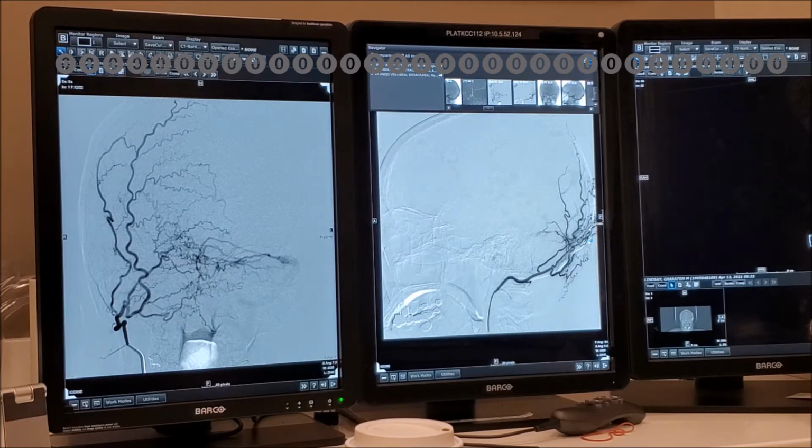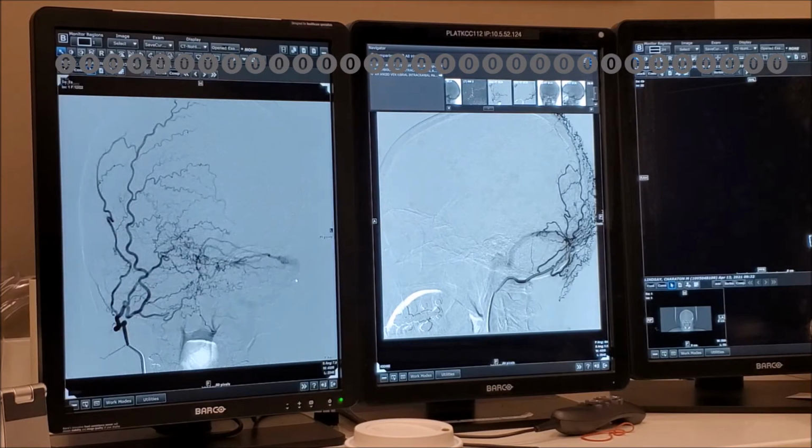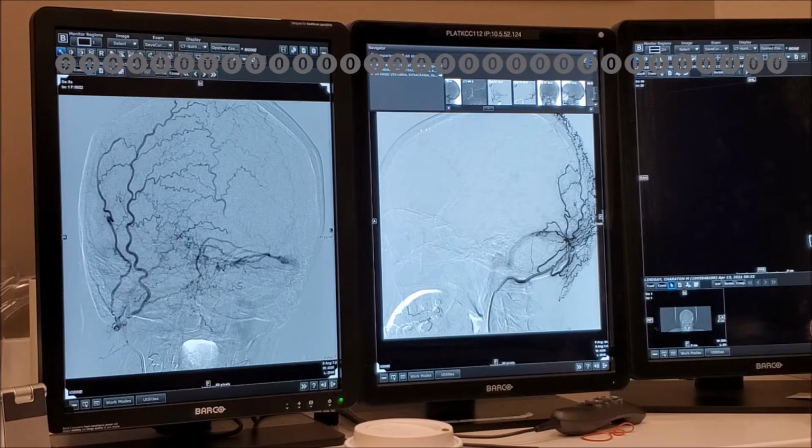I know one thing. It is transbony. It's not meningeal. But it reconstitutes, this is a meningeal artery. But it is through all this, you see all this transbony? Okay. And it's draining to the sinus, right? On the opposite side. Okay, so the money is going to be on the other side, right?